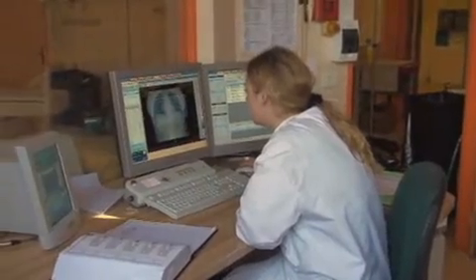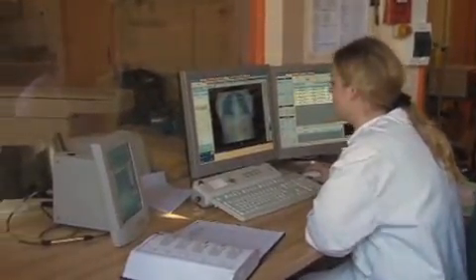If you look at the impact of ICT on patient care, then I must say that it helped us especially for cardiac imaging. And there, the dose reduction, I think, is the most important issue that you have to consider. We're now doing cardiac scanning much more rapidly with much less dose and much less contrast than we did before. Advantages of CT are that we get really a 3D data set, not only a 2D projection. We can visualize changes of the wall of the vessel, coronary calcifications and non-calcified plaques.